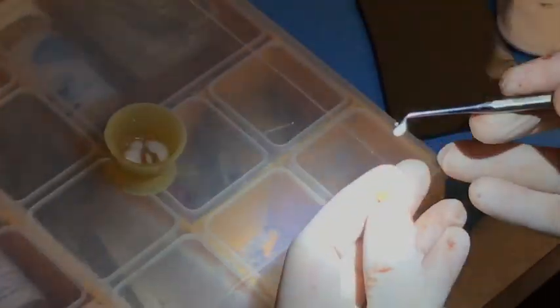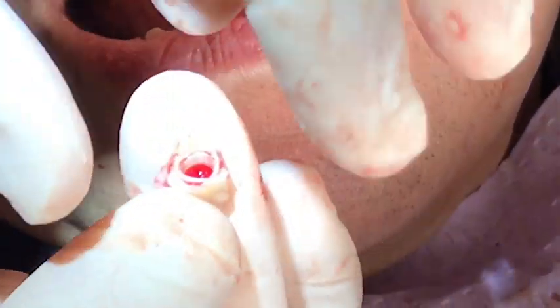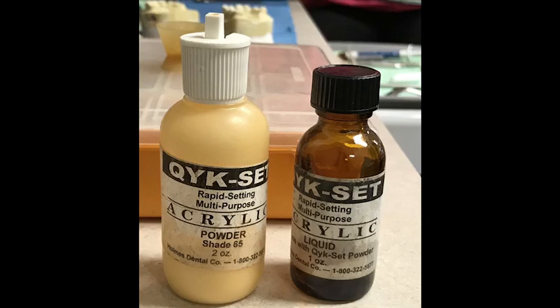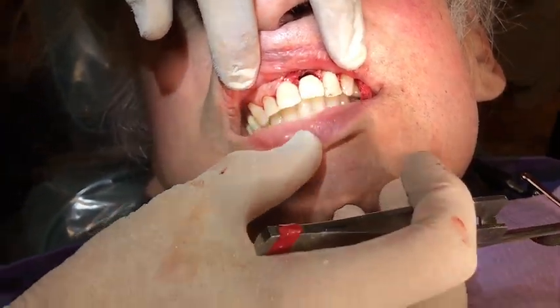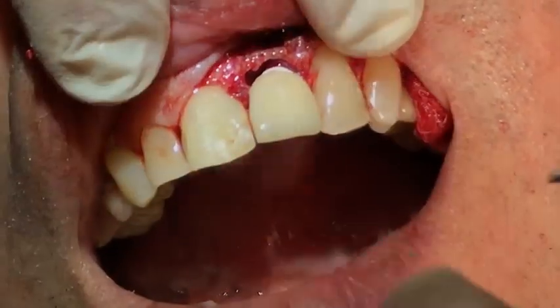Decortication was performed with a 557 high-speed bur that would later help facilitate and promote bone grafting. Acrylic was mixed and the lab-manufactured provisional was seated into place. Care was taken to control the flow of the acrylic. Once the acrylic was set, the cap prepared on top of the abutment was attached to the provisional. The provisional was then trimmed and polished using quick-set acrylic. Occlusion was then verified — centric and working interferences were freed, making sure there was no functional contact. Temporary cement was placed inside the provisional and it was seated into place. This was all done before bone grafting and final suturing.